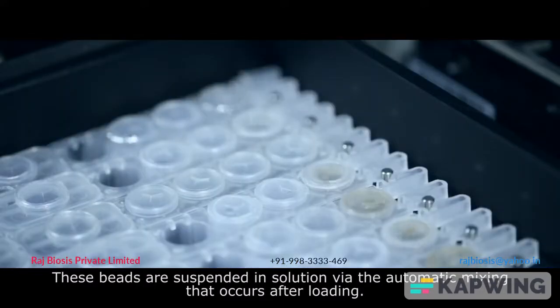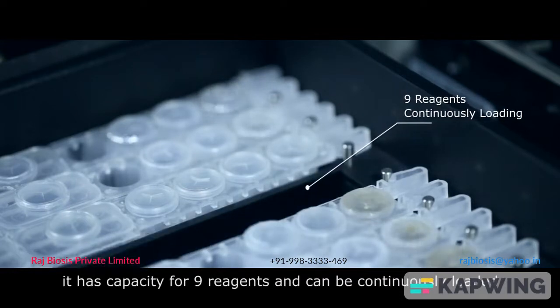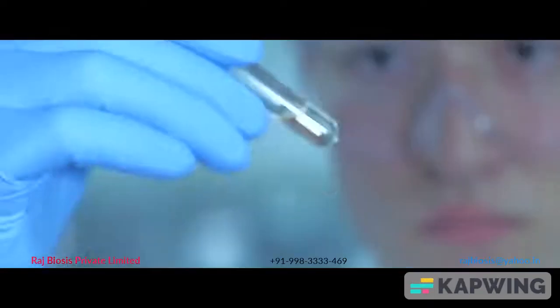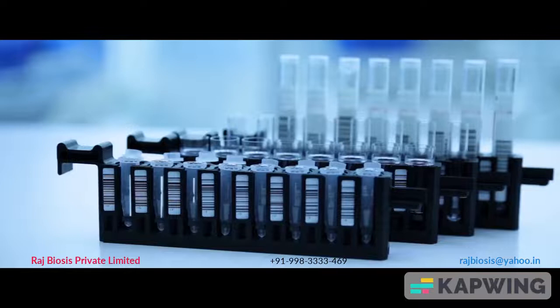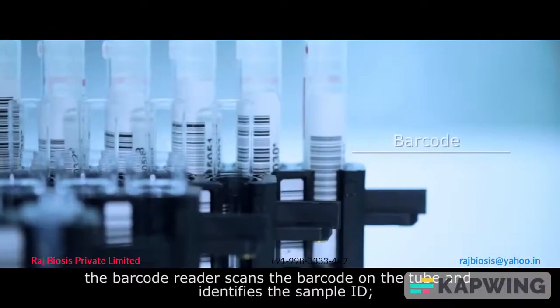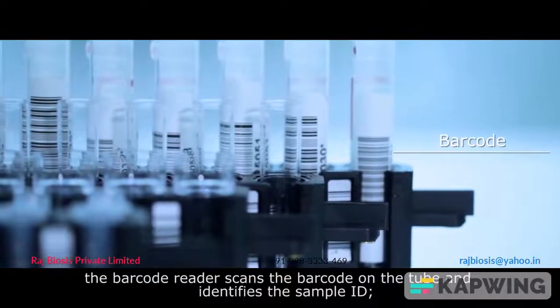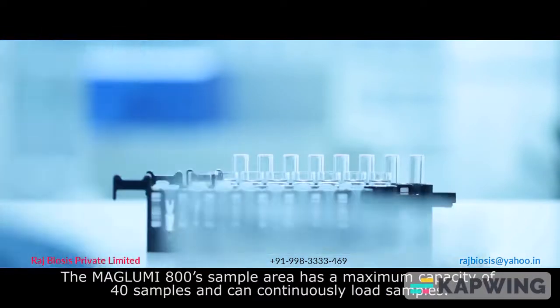The Maglubi 800 has capacity for nine reagents and can be continuously loaded. Samples can be loaded with different types of sample tube. When loading the sample, the barcode reader scans the barcode on the tube and identifies the sample ID, sending that information to the software.